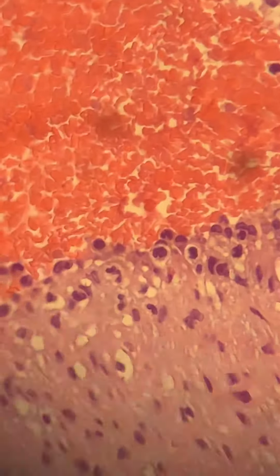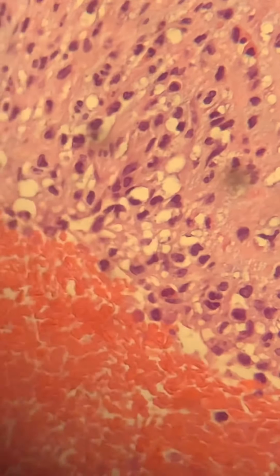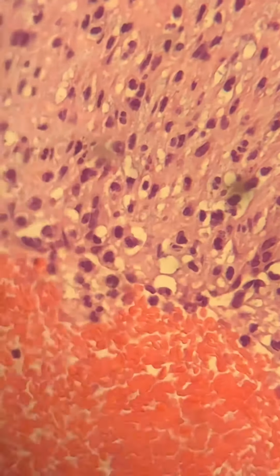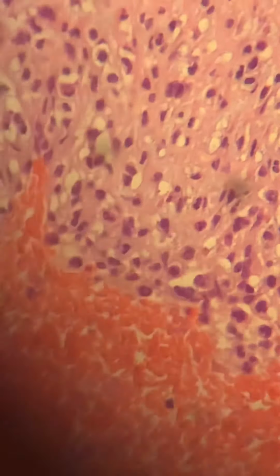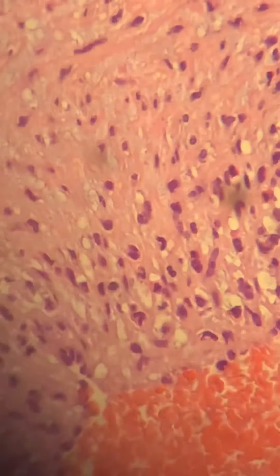Now, some of that might be muscle. Let me see if I can convince you otherwise. I want to get a good view of the inflammation involving the umbilical cord vessel. You can see more acute inflammatory cells there. It's hard to keep it in focus, but you definitely see some inflammatory cells involved in this blood vessel. So that's acute funisitis, okay?